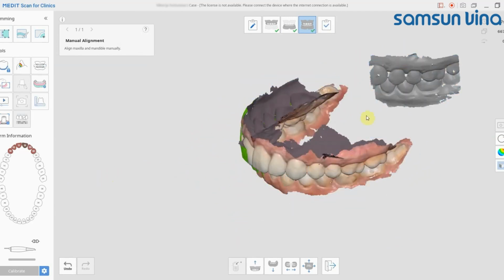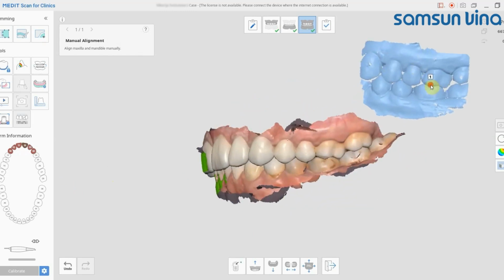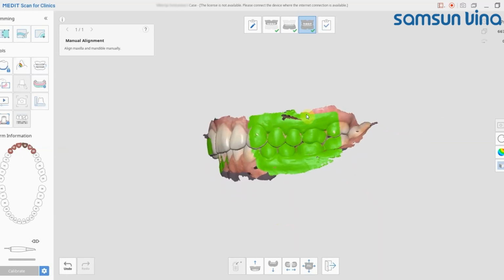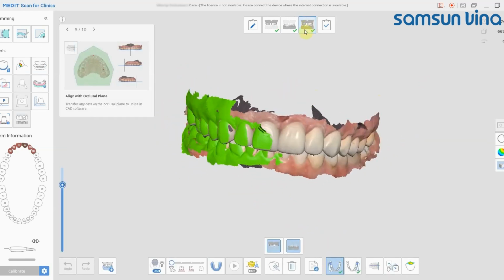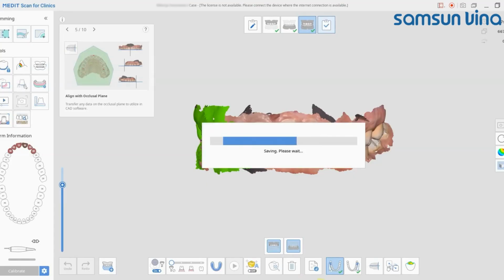So we'll just need to do 1 on this side, so 1's set, so we'll just do the upper. So we'll do a point here, here, and here, and the same here, here, and here, and it should register for both sides. There you go. And then we click the little exit button down here, and there we go, everything's saved. We've got a tick next to the occlusion stage up here, and we can go and process as normal. Okay, so we'll just click the tick and save, which will lead us on to our next problem quite nicely.